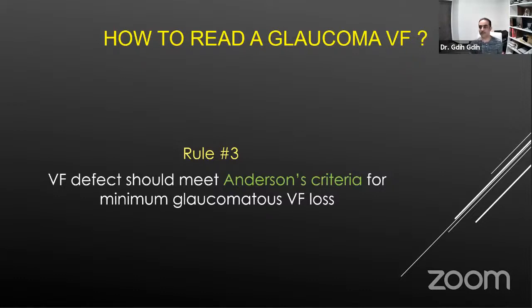But when you test their visual field, it's normal. We cannot ignore that. So there's something called pre-perimetric glaucoma. Just as a reminder, we cannot use this to exclude glaucoma. We use it to diagnose glaucoma and the visual field defect that's caused by glaucoma.